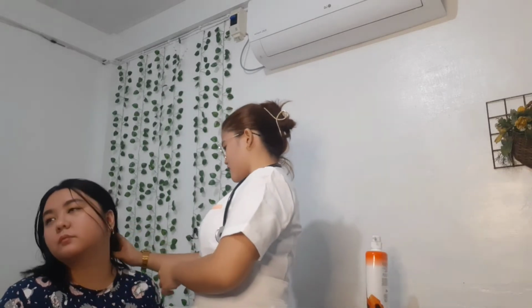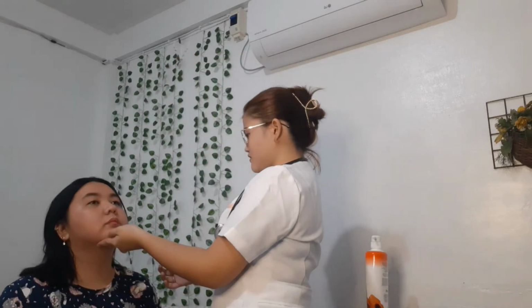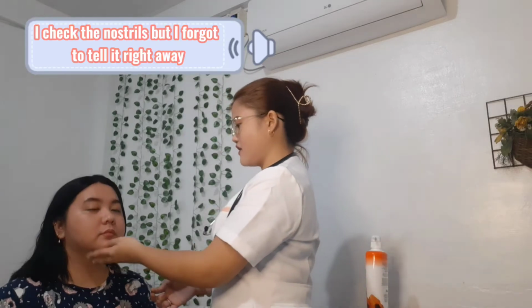Next, you need to assess the nostrils, back of earlobes, cheeks, the tracheostomy site, mouth, or areas of constant contact of the oxygen device with the skin. The rationale for that is in order to make sure it is safe for oxygen administration. So, I will just check your earlobes, ma'am. So, ang likod ng inyong tenga. Okay. Hila po. Okay. Cheeks niyo po. Okay, I checked the nostrils, but I forgot to say it right away.